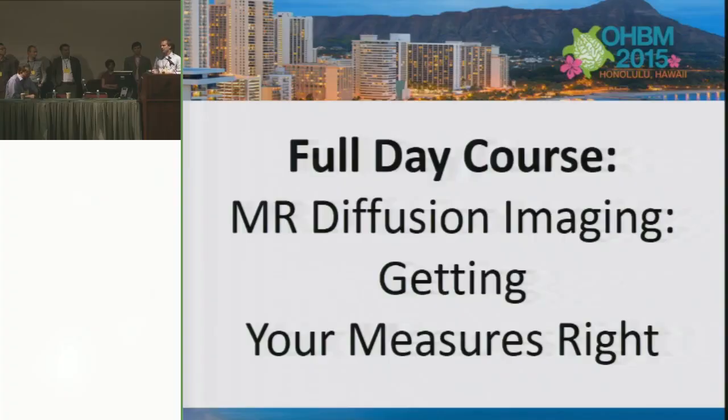If you want to know what the pathology is, then you take that to the histology and try and do some work there. But if your question is very different, say you just want to say, is this relevant? Do I see a difference between two groups? Maybe your DTI may be enough for that. So I think there's no one answer here, but it really depends on what you want to go after.